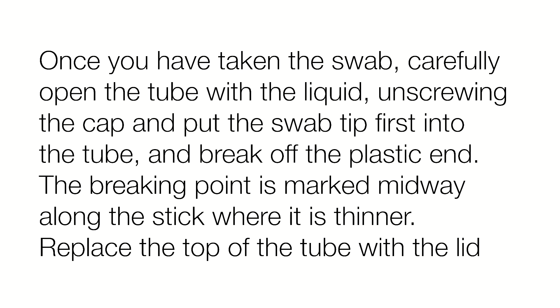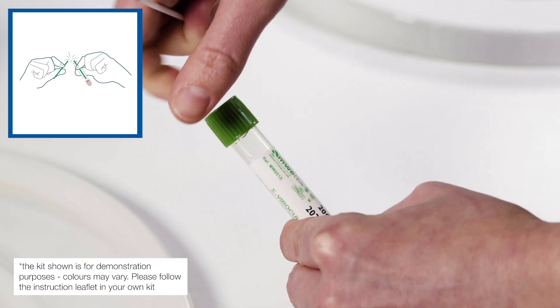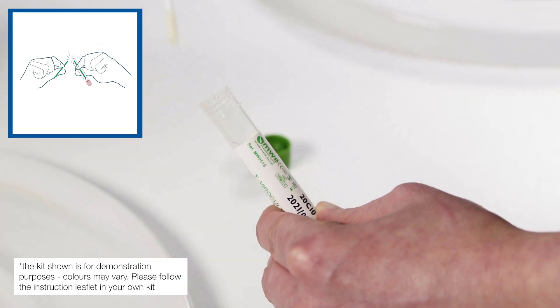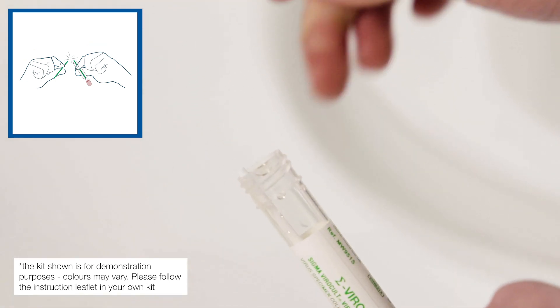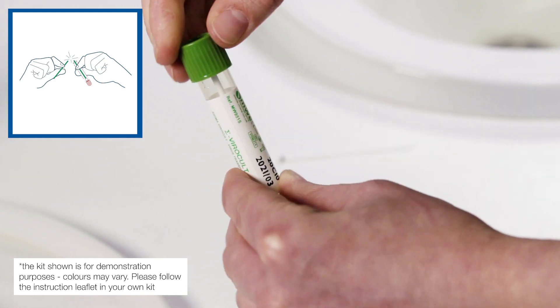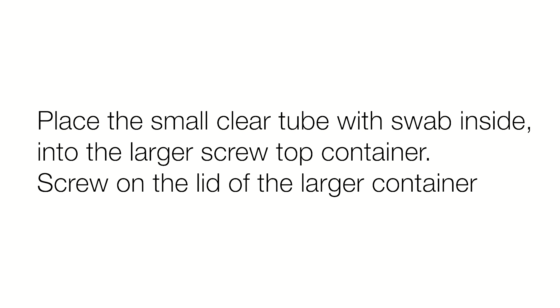Once you have taken the swab, carefully open the tube with the liquid, unscrewing the cap and putting the swab tip first into the tube and breaking off the plastic end as shown. The breaking point is marked midway along the stick where it is thinner. Once it is broken, replace the top of the tube with the lid. Place the small clear tube with the swab inside into the larger screw-topped container and then screw the lid of the larger container closed.